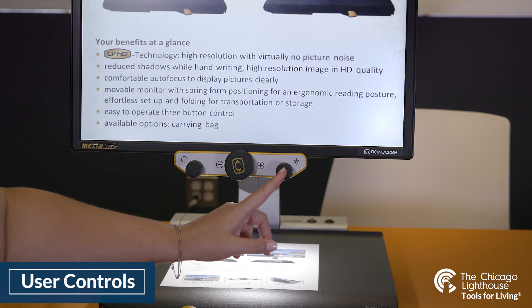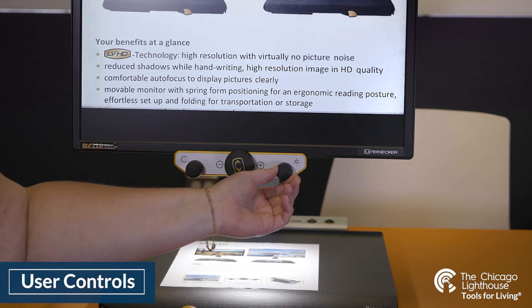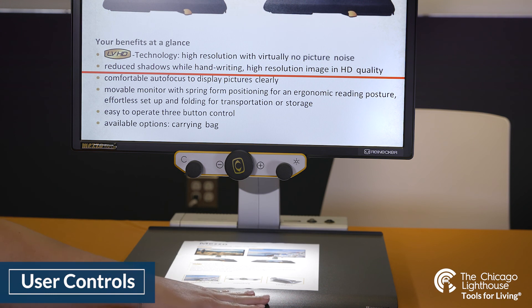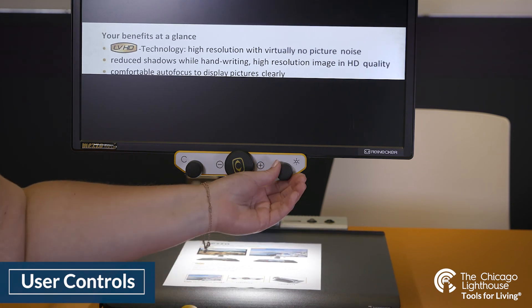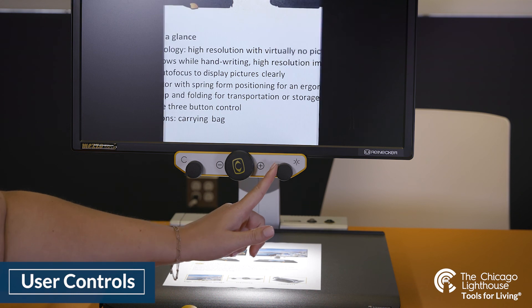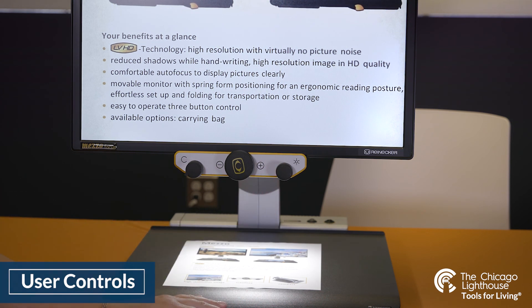If we use the secondary function on the right dial by pushing inward, it will bring up controls to create blinds lines or a reading line. This can be very helpful for people who have tracking issues when reading, keeping them level along with the XY tray, or for those overly stimulated by too many words on screen. Pressing it again inward gives us a curtain mode, and we can also bring up a vertical reading line. Press it once more and we are back to standard.